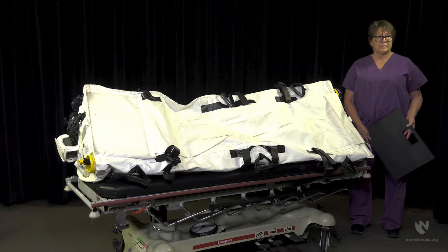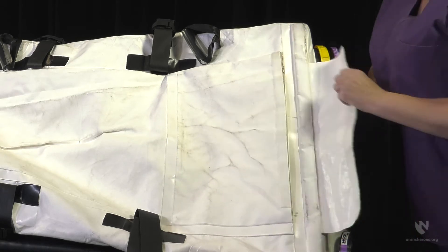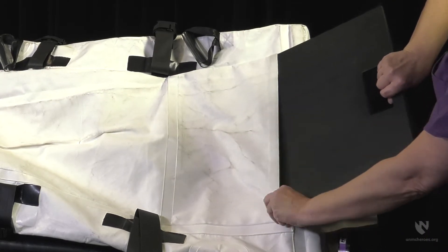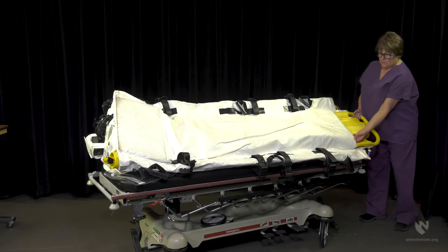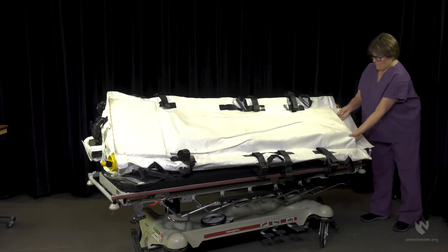At this point, you will need to turn the enclosure on its side to insert the black support plate. The pocket for the support plate is the smaller of two pockets located on the head end of the enclosure. Insert the support plate and secure with the hook and loop closure. If a spine board is to be used during transport, it will be inserted into the remaining pocket at this point.